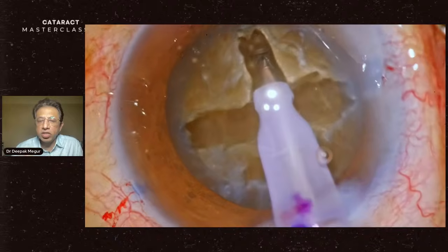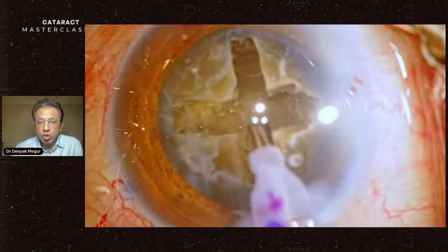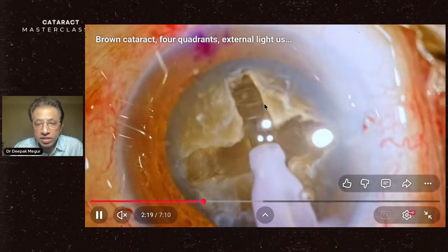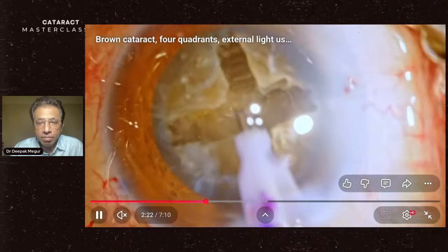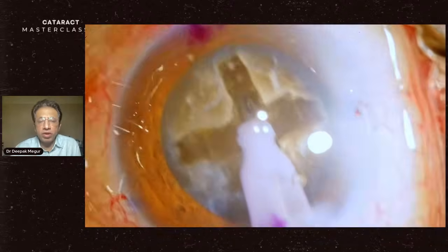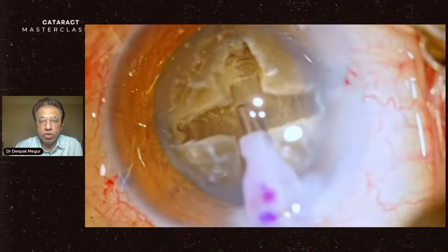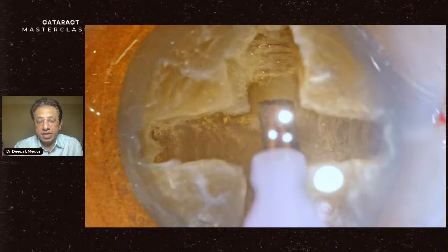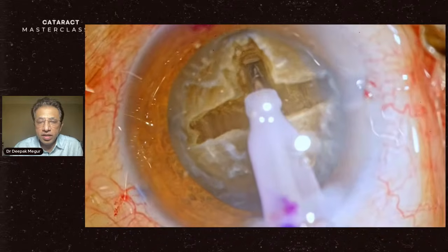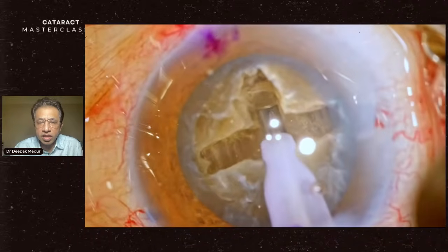The key here is to reach the most posterior aspect of the posterior plate. Then you are going to have an easier separation. You can see that these striations are still present; they've still not faded away completely. I'm just trying to go in as deep as possible. When you look down through the microscope, sometimes it's very scary. You feel you're going too deep. Invariably our sculpting is not as deep as we would want. That's the secret here. So I'm just continuing to sculpt until these transverse lenticular striations give way, and there's a small change in the color of the plate.